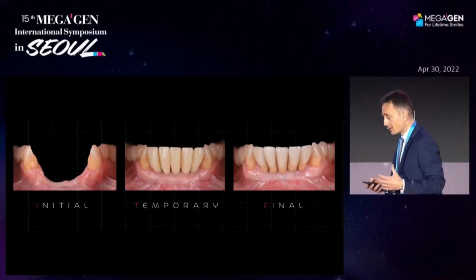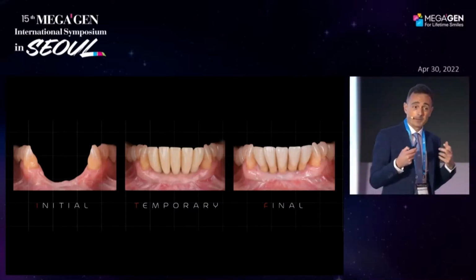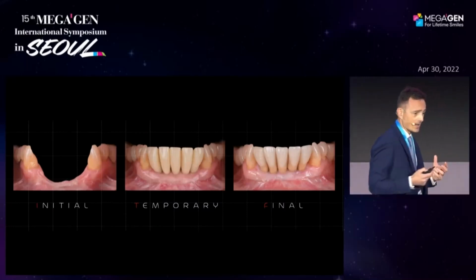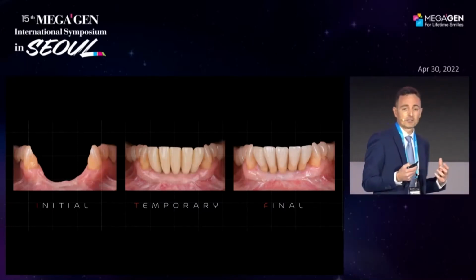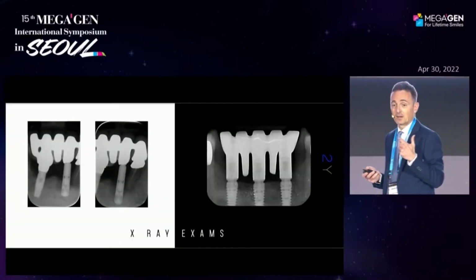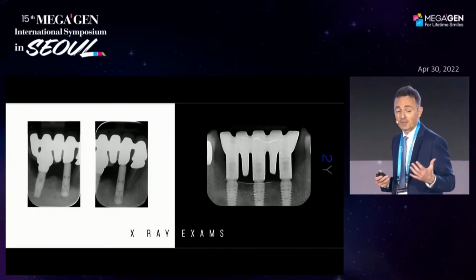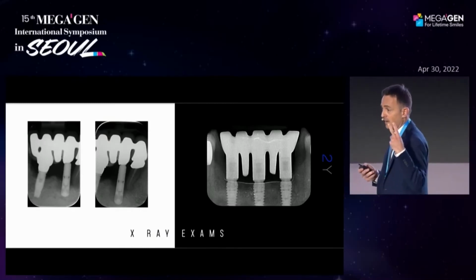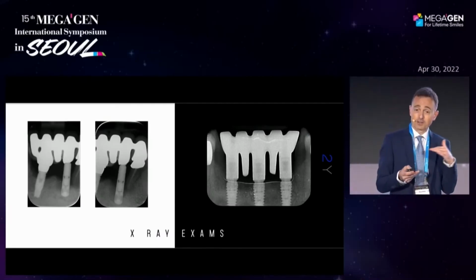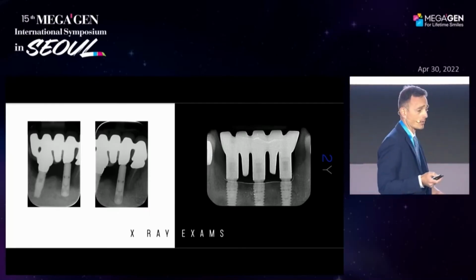I would like to remind you that the patient needed to be really motivated to face this kind of rehabilitation, because I think I performed this clinical case in at least 2 years. And the most important thing is that comparing the initial with the final X-ray exam, we can see that everything is fine. After 2 years of follow-up from the prosthetic loading, we can see a sort of crestal corticalization of the regenerated bone.